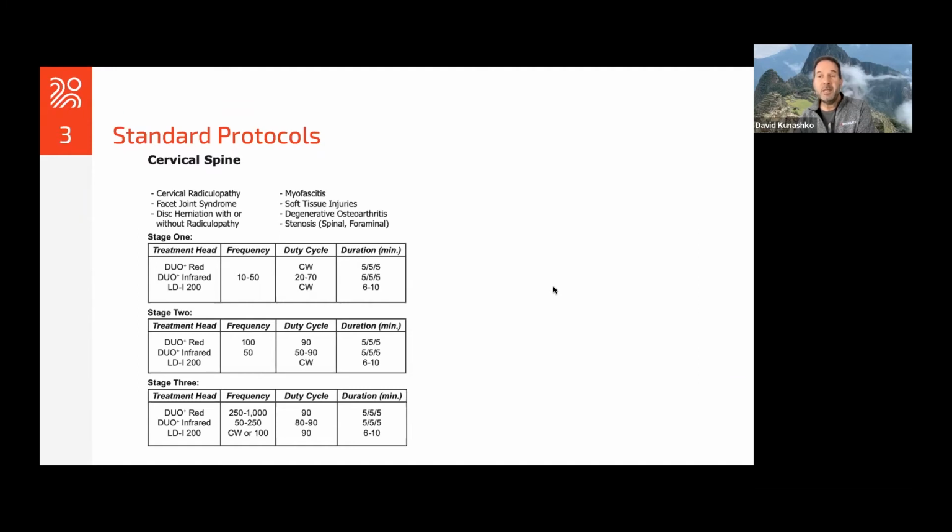Depending on your geographical region, Canada, the United States, Europe, Australia, different areas, they have different regulatory bodies that control what we can or can't put into software, the protocols, because they may not feel there's enough evidence to support the use of photobiomodulation for those specific regions or conditions. Usually it's a condition. It can be challenging because if you look at the body of research for laser therapy, there's thousands of papers to choose from, but it doesn't mean that there's thousands of papers on shoulder, for example, or herpes zoster, for example, or gout, for example. There's many examples where they may not approve the use of photobiomodulation as far as marketing goes into our software, because that's what they look at.